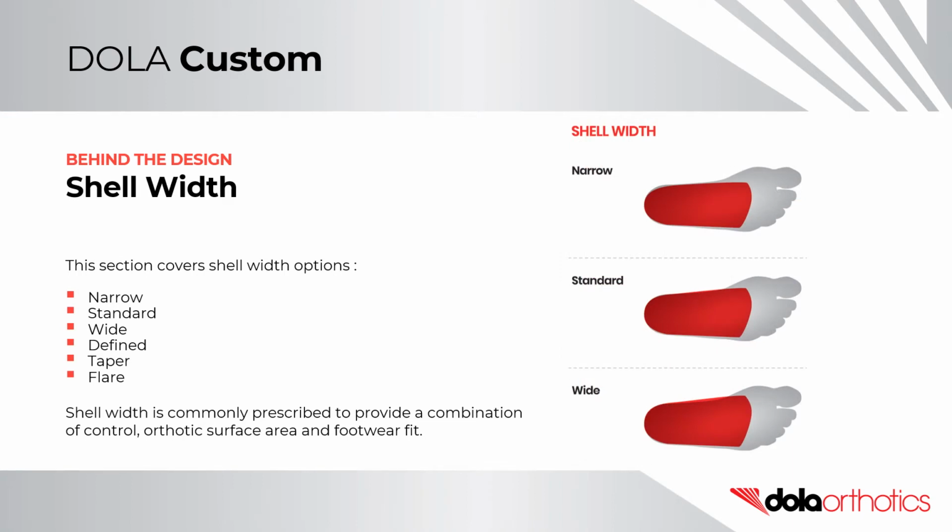Behind the design. Orthotic shell width. This section of the presentation will cover orthotic shell width options, including narrow, standard, wide, practitioner defined, tapers, and flares. Shell width is commonly prescribed to provide a combination of control, orthotic surface area, and footwear fit.